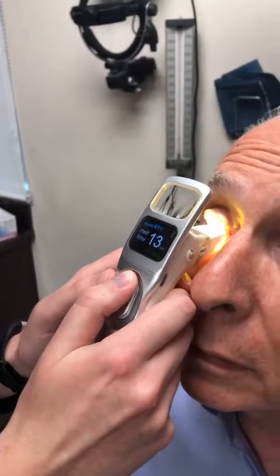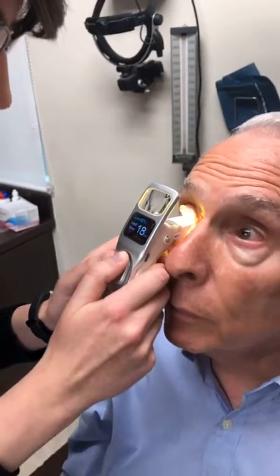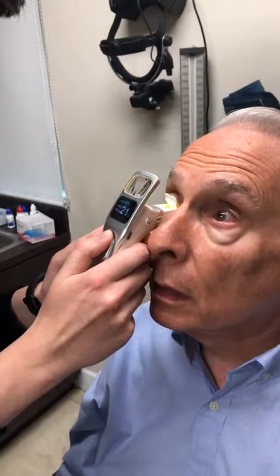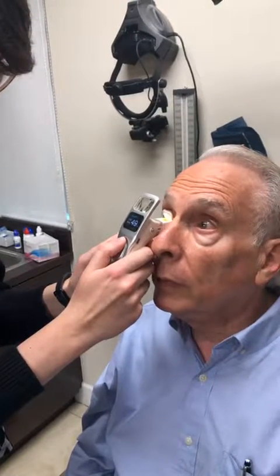Can you see some of the oils coming out? Yeah. One of the most common causes of dry eye disease is a condition called meibomian gland dysfunction. If the meibomian glands get blocked or if the openings are capped, the oil does not mix with the tear film, and you get evaporative dry eye. By keeping the glands functioning and the openings open, we get a much better ocular surface tear film. It feels good. You want to do the upper lid? Yeah, okay.